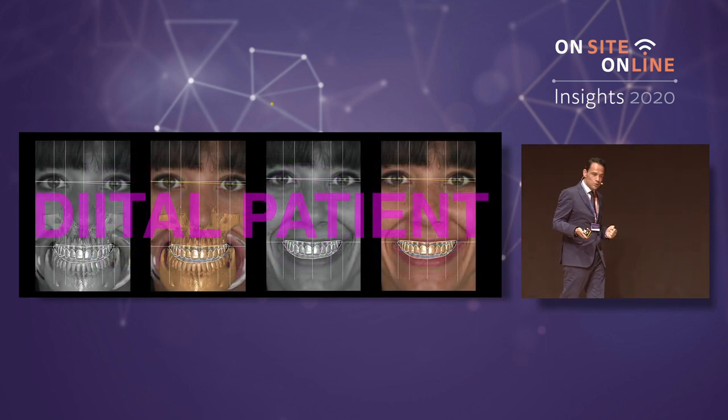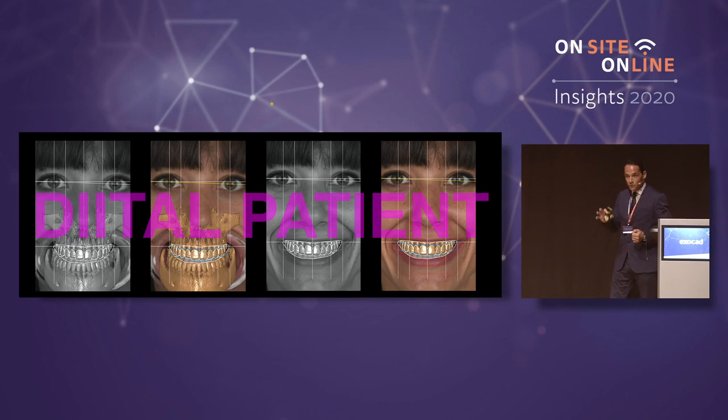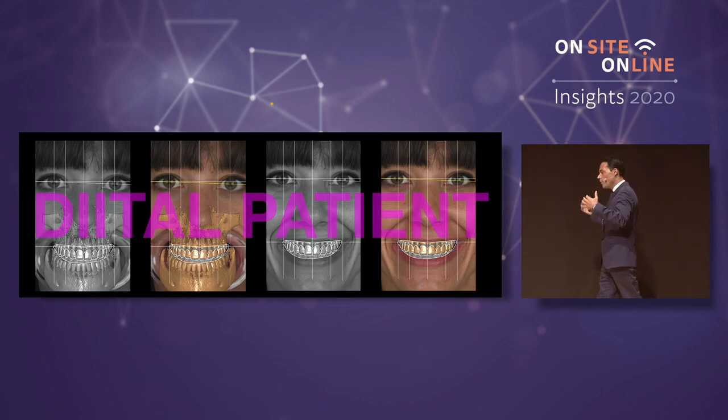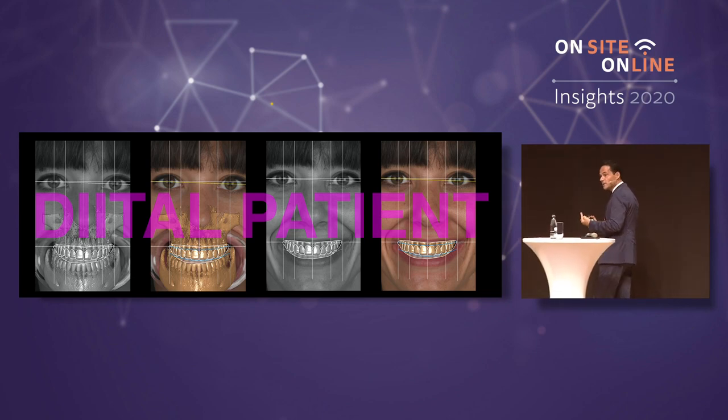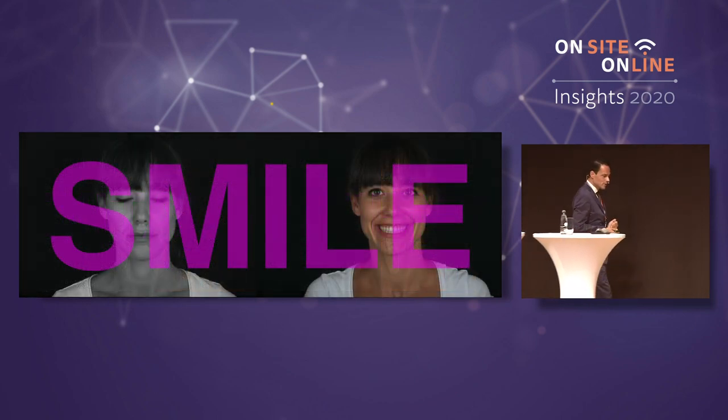Imagine the possibility to align the DICOM files using dental CAD. Why in dental CAD? Because I can export the STL file of my planifications, and if the doctor, the surgeon I cooperate with, is not an exoplan user, he can open my wax-up in the DICOM coordinate system. I have saved it, and he can see this wax-up aligned with the TAC, with the DICOM file, in his own visualization. It is extremely important.